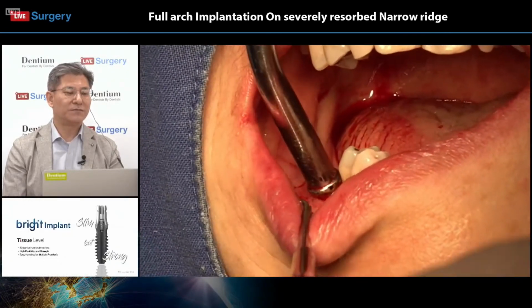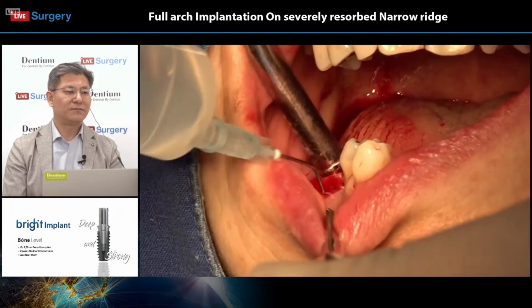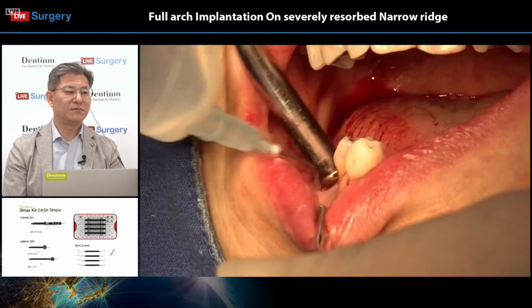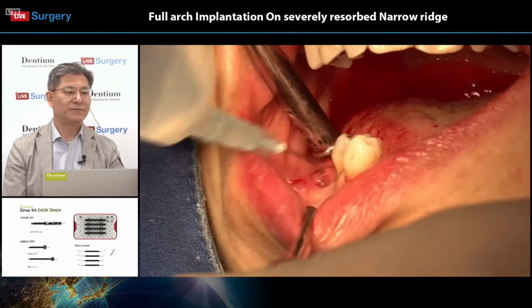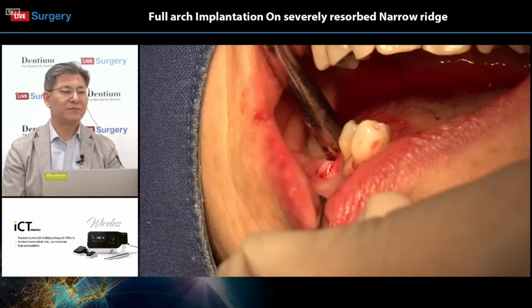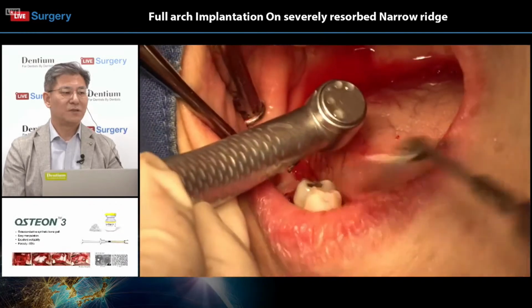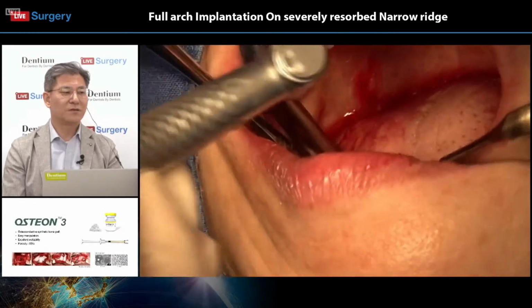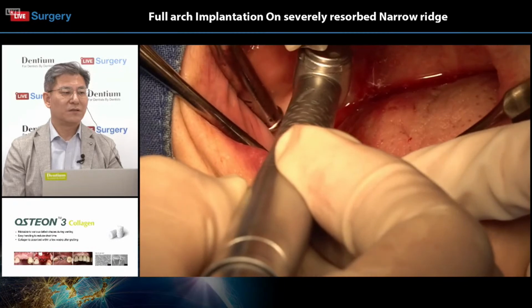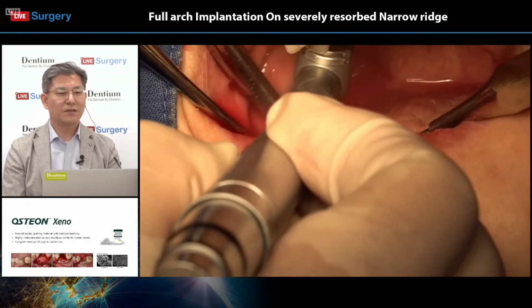Okay. Yeah, so he first positions number 47.